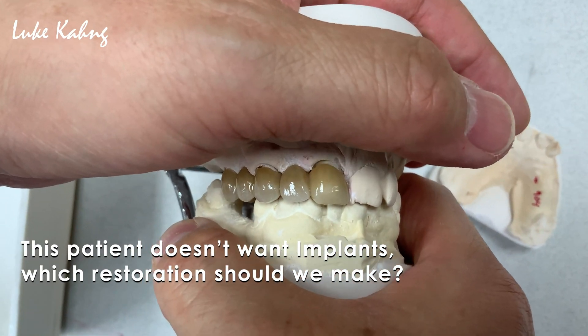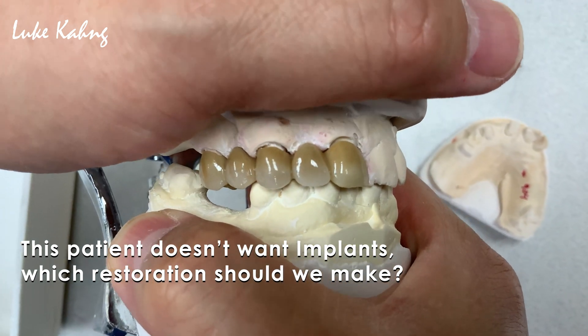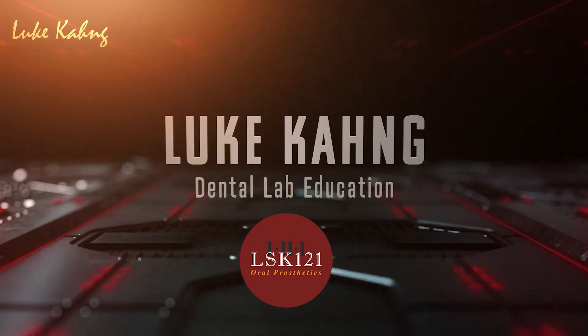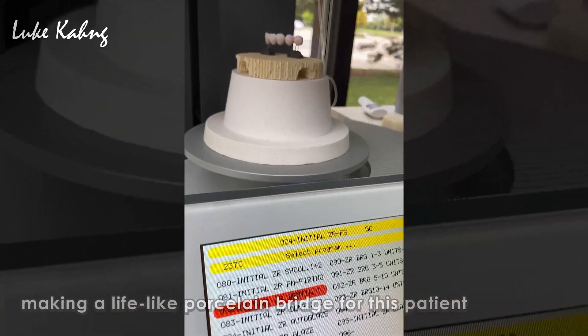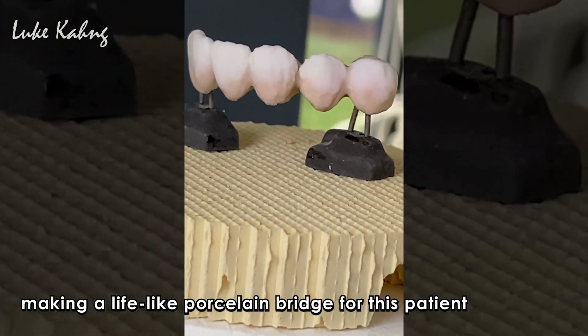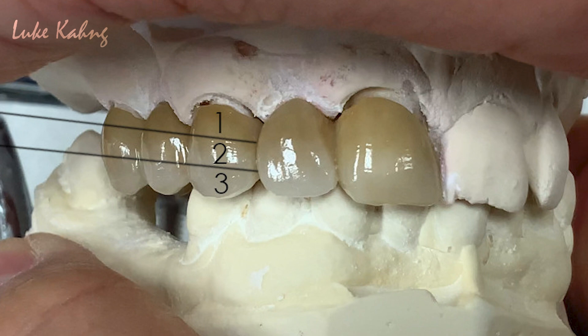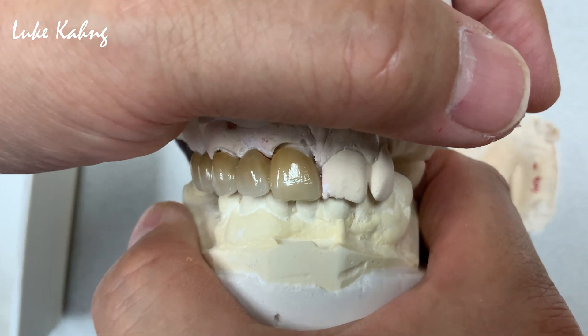Look at this aesthetic. You saw all my porcelain build-up from the one-stop build-up technique with the brush. Notice here that Luke has used three subtly different shades of porcelain. This creates a layered look, also known as gradiation, which creates a more natural-looking tooth that blends more perfectly within the natural adjacent teeth in the patient's mouth.